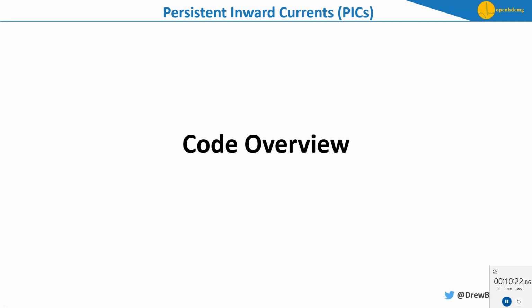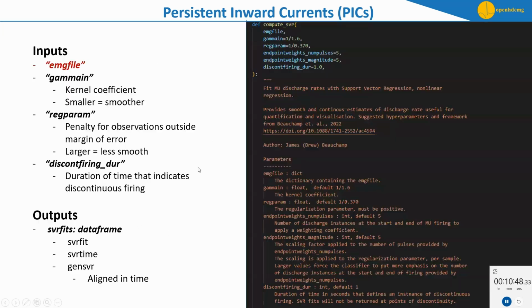If you have any questions, in the discussion section you can ask questions, or I'd be happy to meet with you at any time. But for the coding overview, which I imagine most of you are more interested in seeing, I'll first outline the functions that we've developed, their inputs, and their outputs, and then I will go through a script where we'll just show the functions working and the outputs.